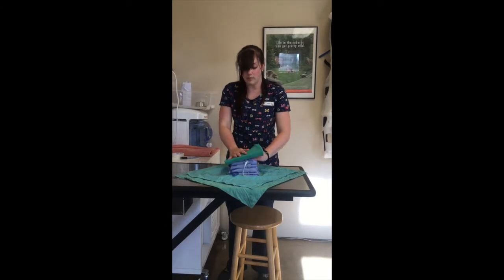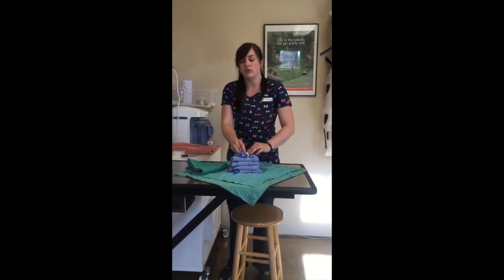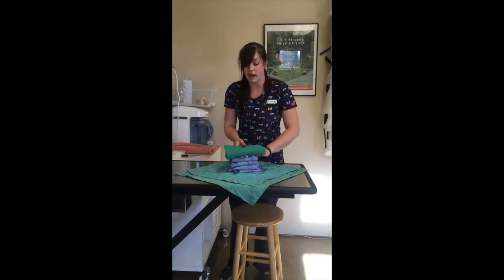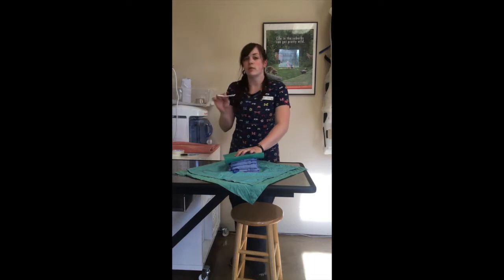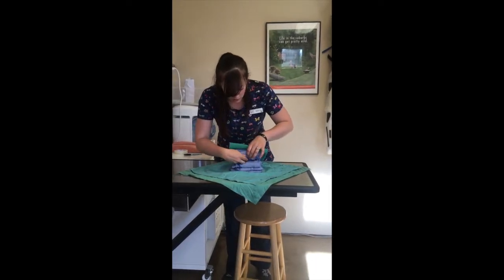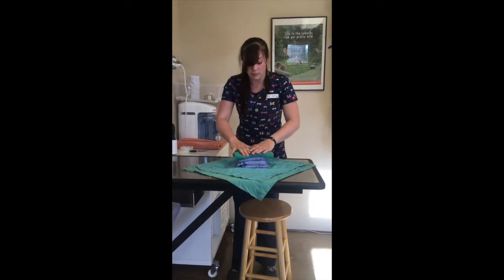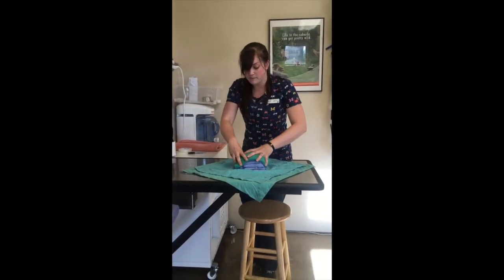and I'm going to make sure the strings are right on top so the doctor can grab those and pull it directly up. I'm going to put my towel that they're going to use to dry their hands after they've scrubbed right on top. I want to make sure I put my indicator strip in the center of the pack. That's going to let the doctor know that yes, this pack has been completely sterilized to the very, very core, and I'm going to start wrapping.